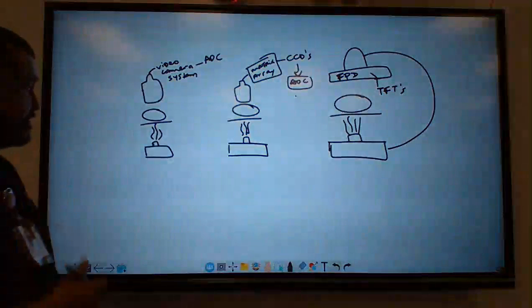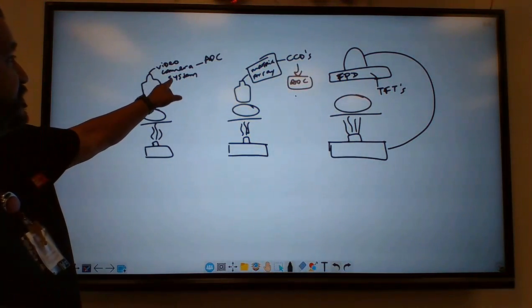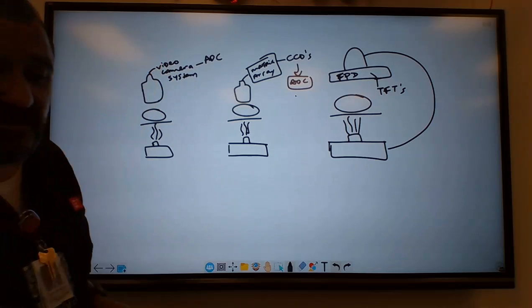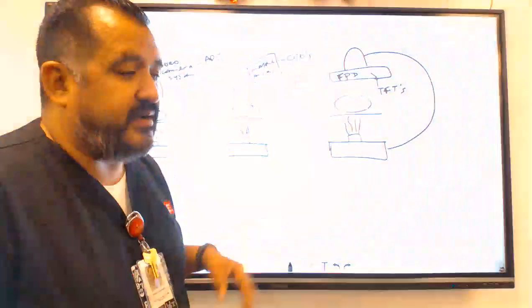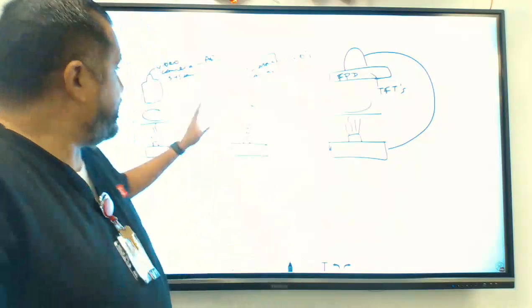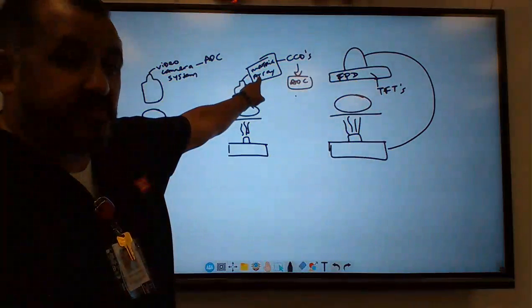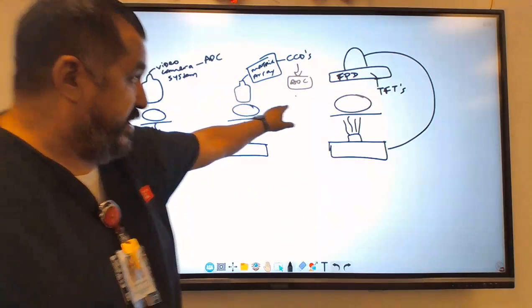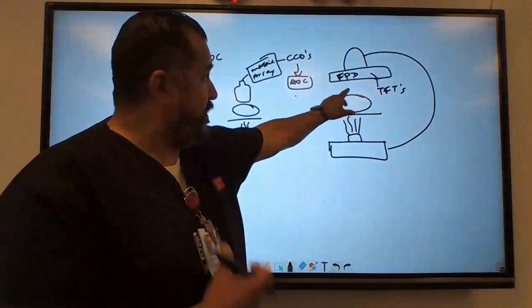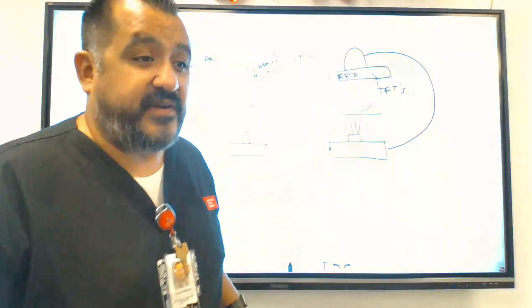But here you go, you guys. This is what we covered, right? Back in the days, we had a video camera system, and there was all these other materials like Plumicon and Vitacon, not Vicodin, right? Vitacon, Plumicon, and you have the electron gun. This is old school. And then we went to digital, and they used CCDs, a matrix array connected to the intensifier. But now, the new systems have a flat panel detector, and it eliminates the intensifier too.